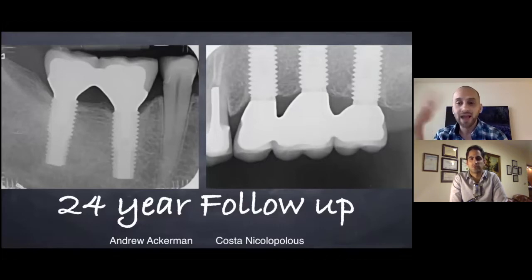I'm not asking anyone to pay attention to whether they're splinted or not. This is an immediate load case that was done too long ago. Splinting is a different topic that we're not going to get into, but I just want people to pay attention to the bone levels after 24 years of service. I would call that success, right?